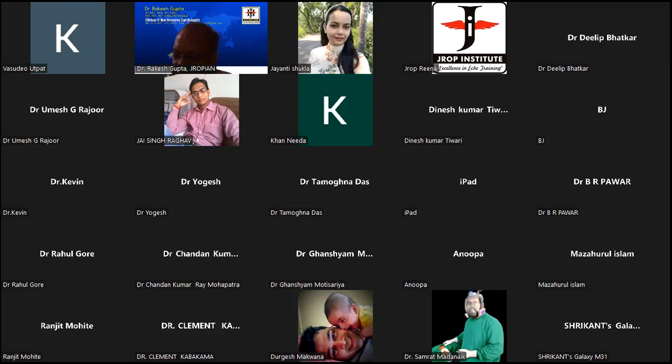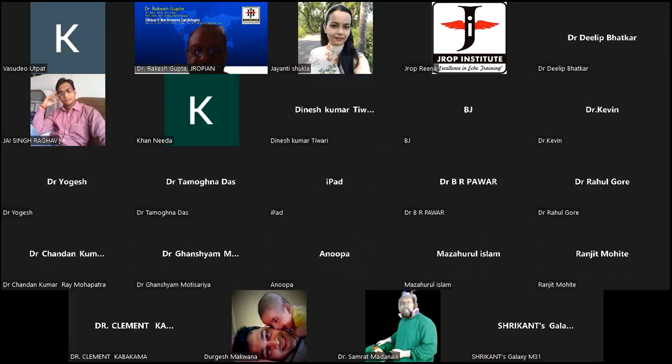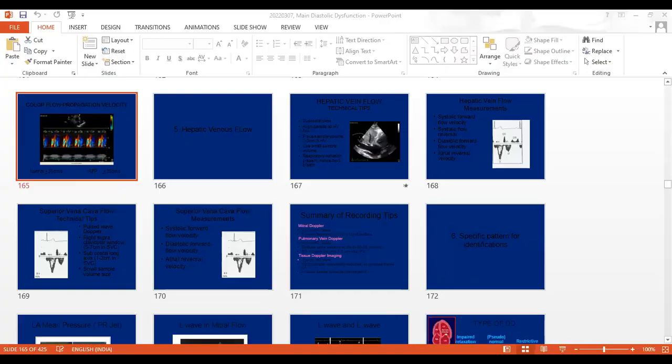Rahul Gore. Sir, can you tell the pulmonary venous flow pattern? Pulmonic venous flow pattern. Okay. Can you see the slides now again? Yes, sir.